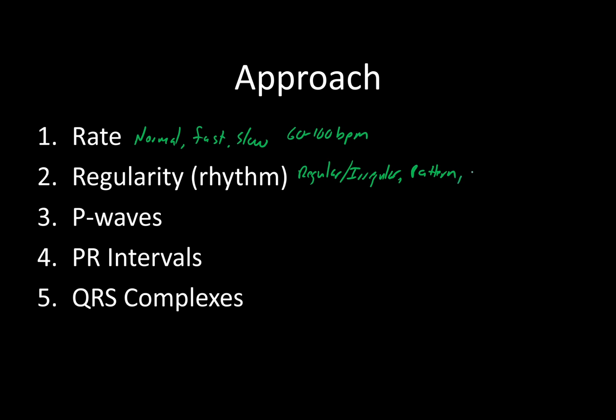And lastly, you're looking to see if there's any ectopic beats. And that really ties in with the irregularity, because you ask the question, why is it irregular? Is it due to any ectopic beats? And so those two feed into one another.